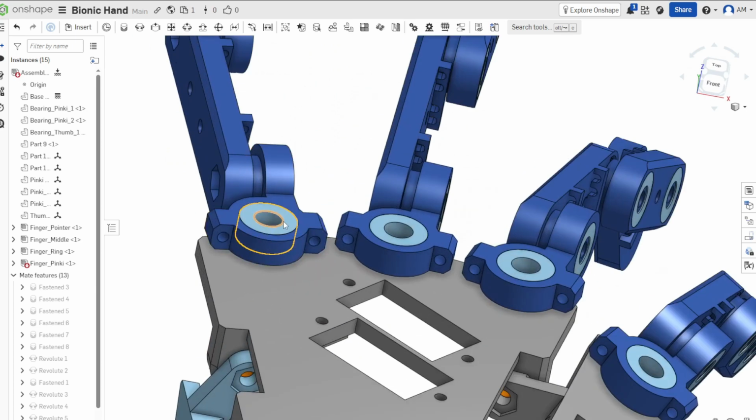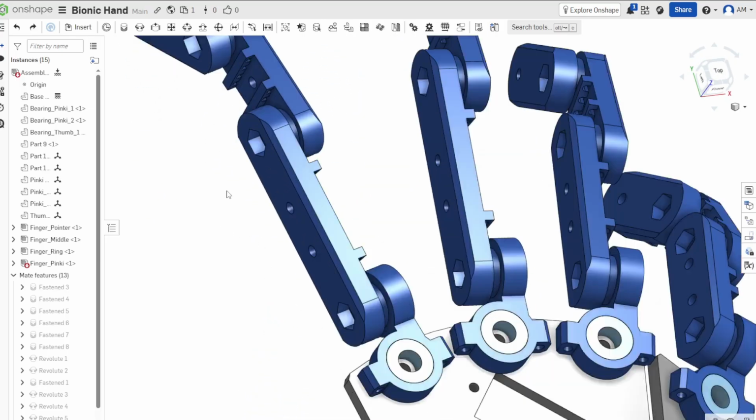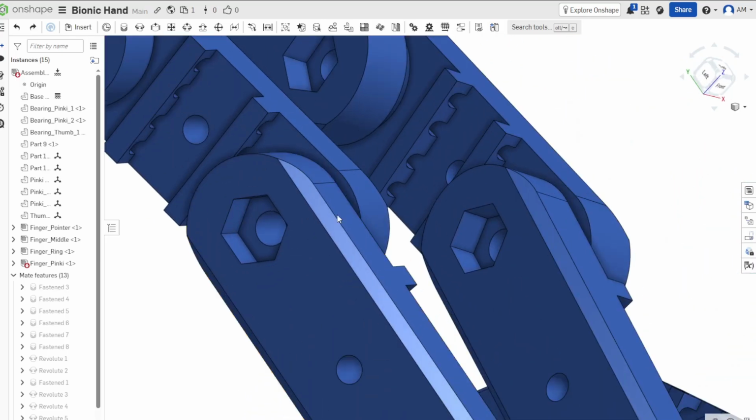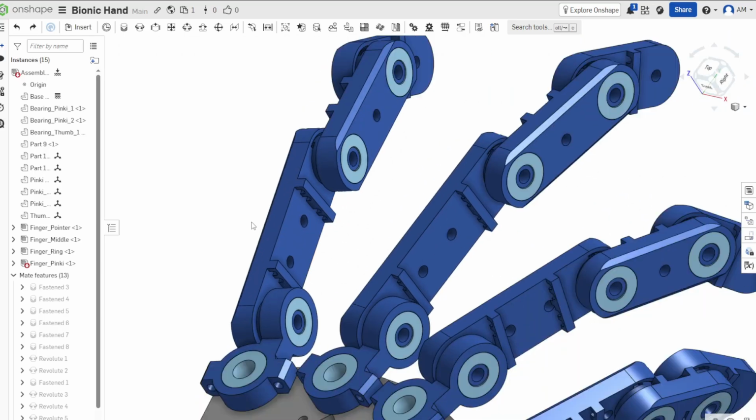So all these components, these bearings are just like 15 bucks off Amazon for enough to build this whole thing. Ace Hardware, you can go pick up the nuts and screws I use. The smaller screws, I got them from a kit on Amazon, but they're going to be everywhere.